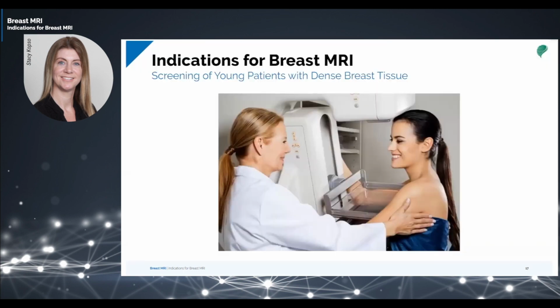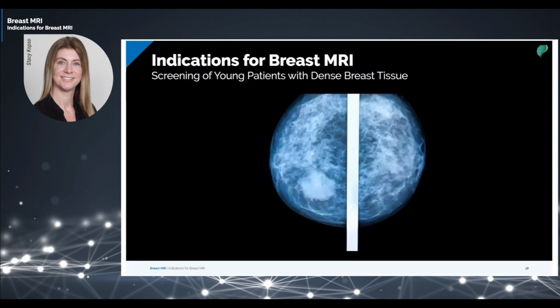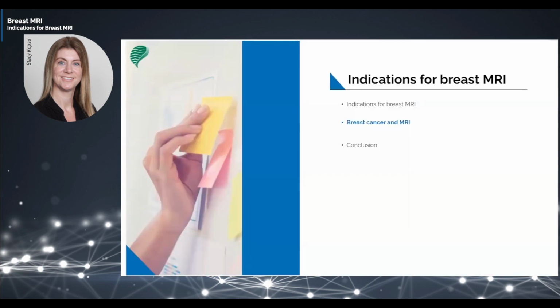Younger women under the age of 40 are not candidates for mammograms for two reasons. One being that it is better to avoid radiation in this area at a younger age, and the other being the density of the breast in this age range. Some women above 40 have dense breasts as well. The tissue of dense breasts may be obscure on a mammography, which is why MRI is recommended for better and more accurate screening.